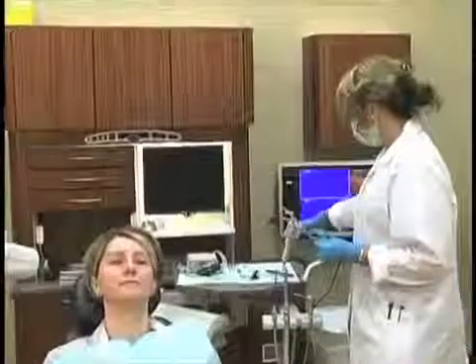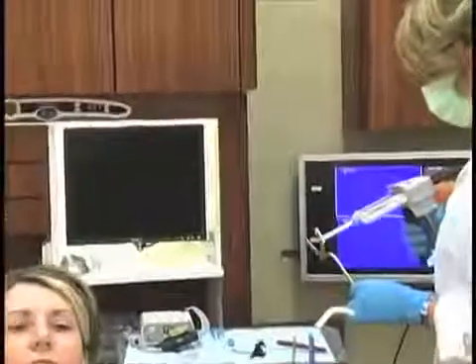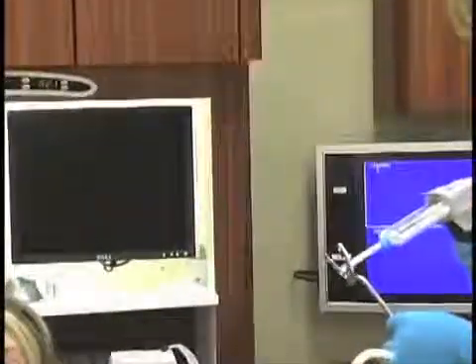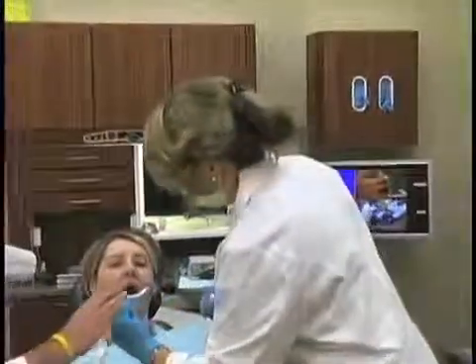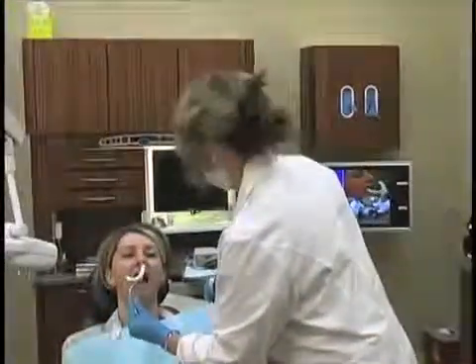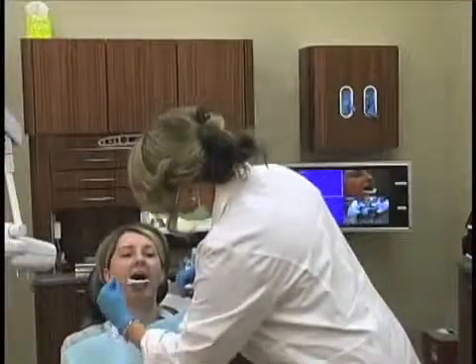And we like to utilize just a polyvinyl material. This happens to be just a bite registration, a polyvinyl bite registration material that is going to be squirted on the bite fork. You can also use compound if you prefer that. This just seems to be very, very easy. And she's just going to pause outside of her mouth just for a second so you can see it.